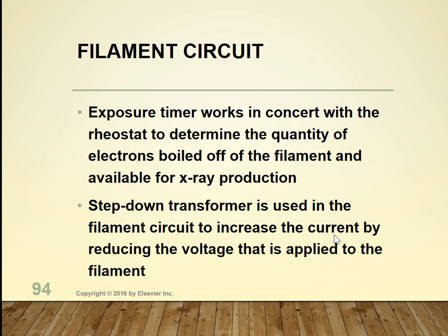Okay, it should be noted that the exposure timer works in concert with the rheostat, and that rheostat controls filament temperature and the rate at which electrons are boiled off of the filament. The timer determines the duration of this process. Together they determine the quantity of electrons that are boiled off and available for X-ray production. Okay, so the exposure timer and the rheostat, where mA and time determine the quantity that are boiled off for X-ray production.